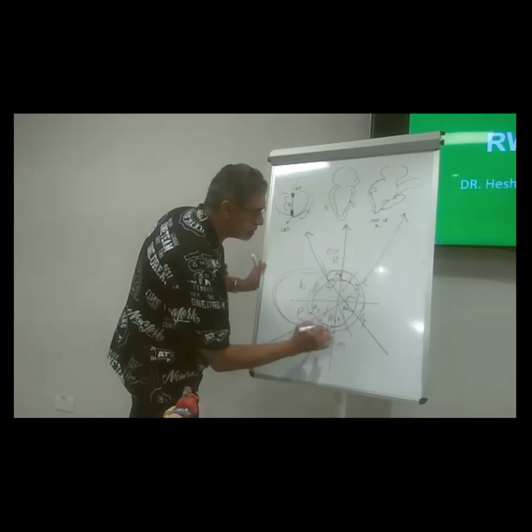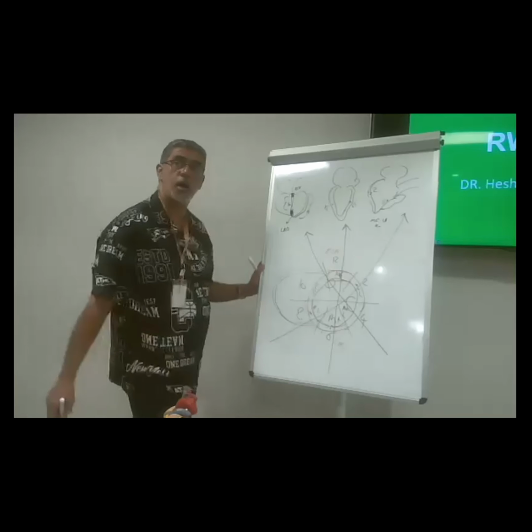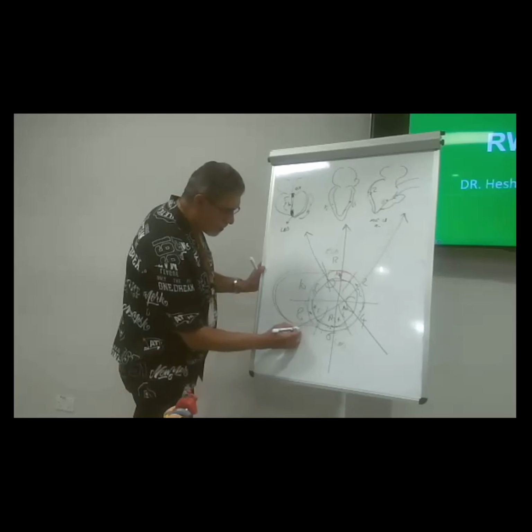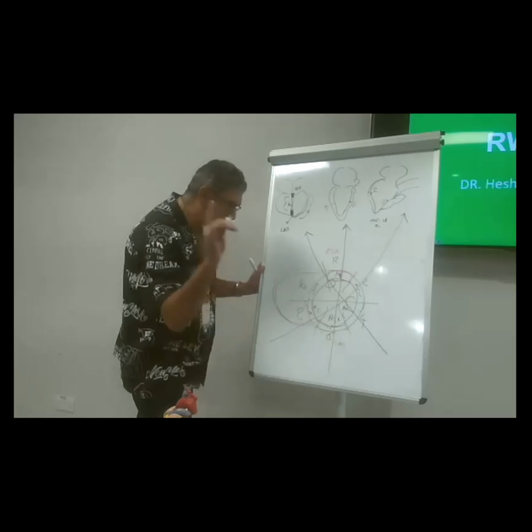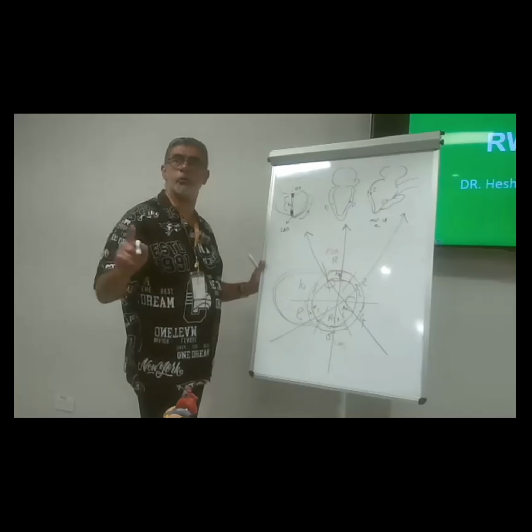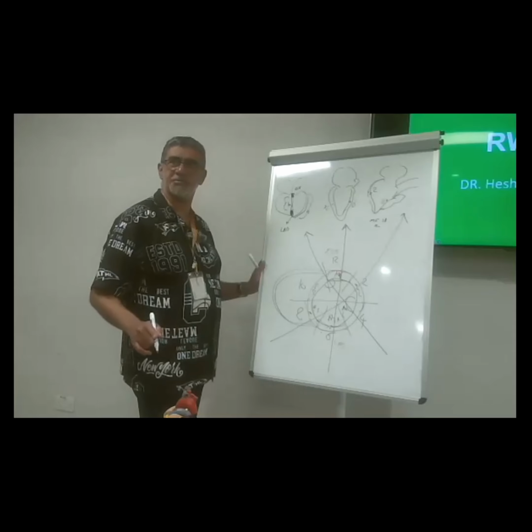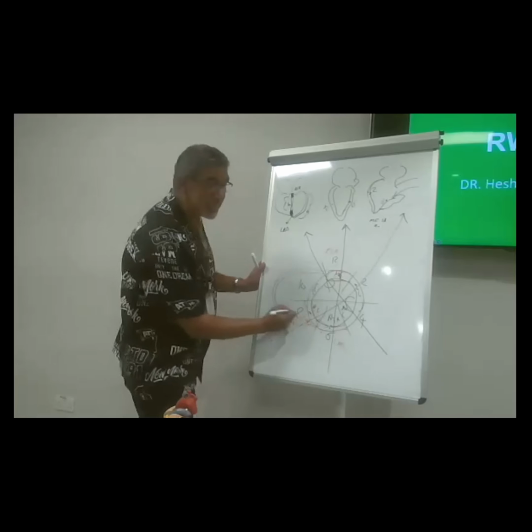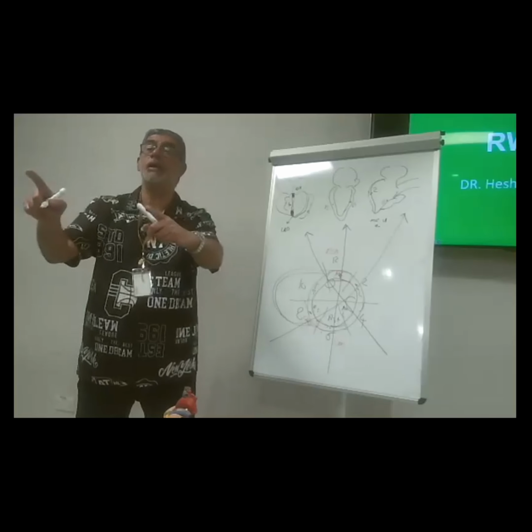Pure LAD. This one? Anteroseptal. What supply? Is it LAD or RCA? No. Don't say or. Yes, I'm aggressive. LAD pure.